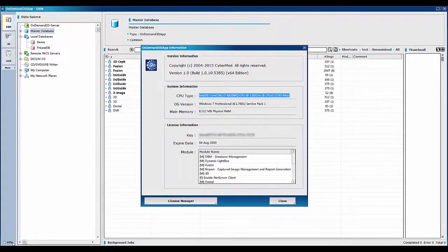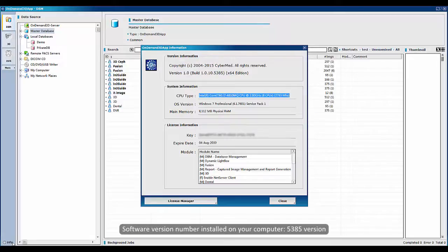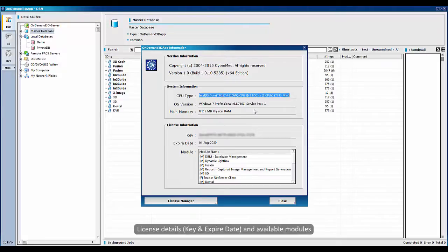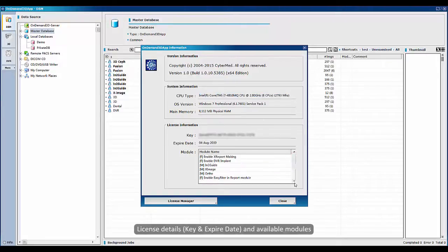From the On-Demand 3D application information window, you can see the software version number that is installed on your computer, which is version 5385, system information of your computer, as well as the license details and available modules.